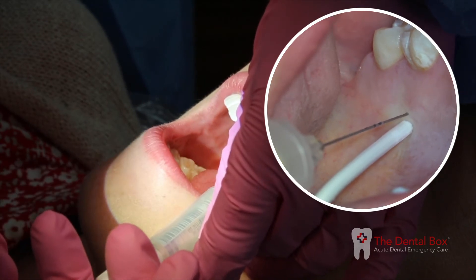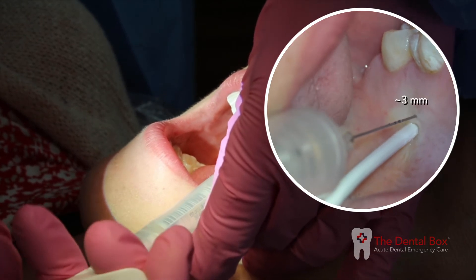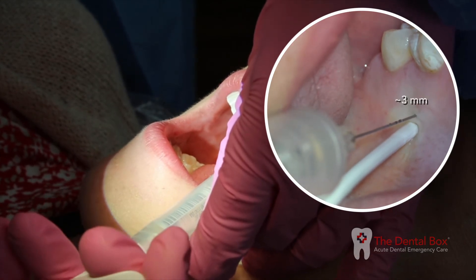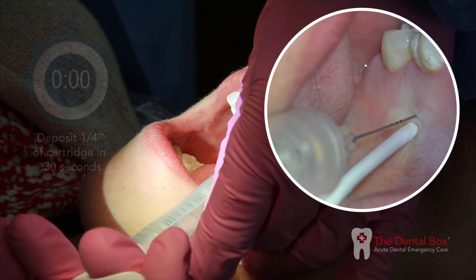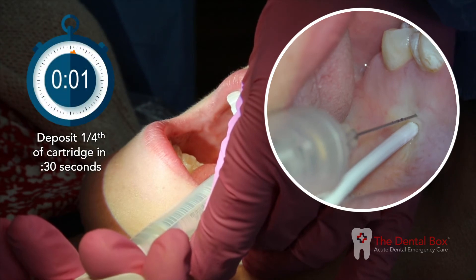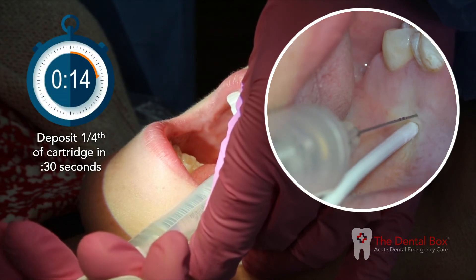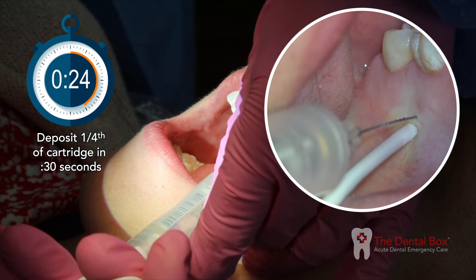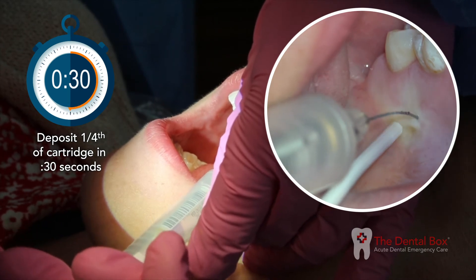Penetrate the blanched site approximately three millimeters. Aspirate the syringe. If negative, slowly deposit one-fourth of a cartridge over 30 seconds. You should feel considerable resistance in the syringe.